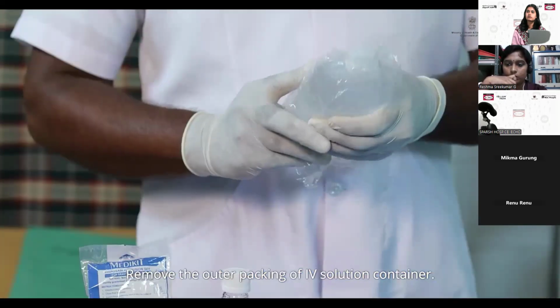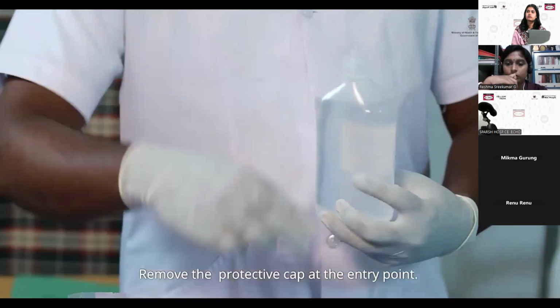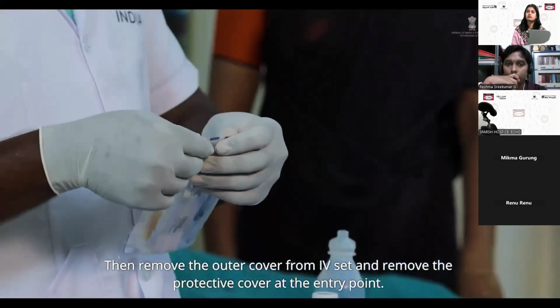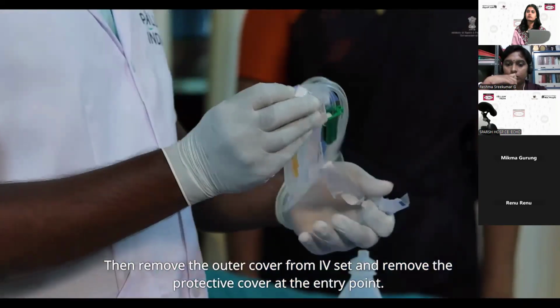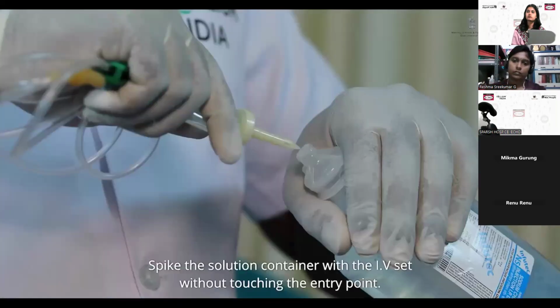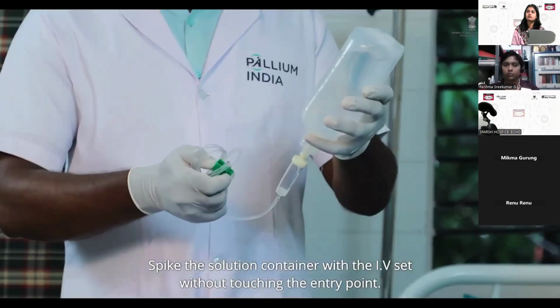Remove the outer packing of IV solution container. Remove the protective cap at the entry point. Then remove the outer cover from IV set and remove the protective cover at the entry point. Spike the solution container with the IV set without touching the entry point.